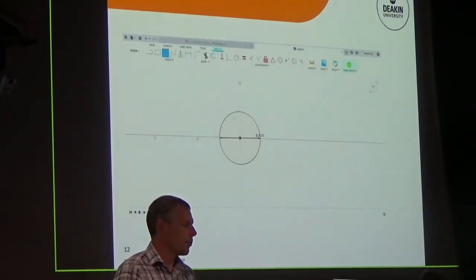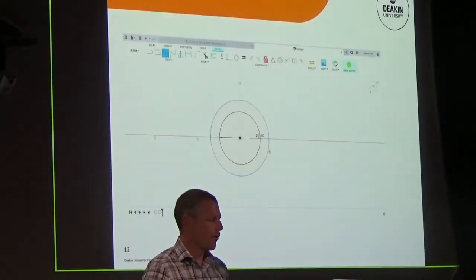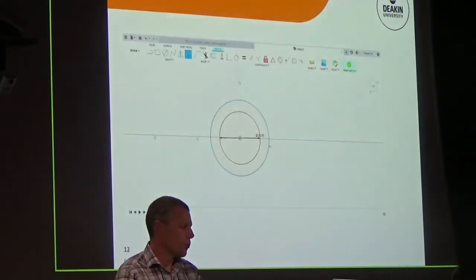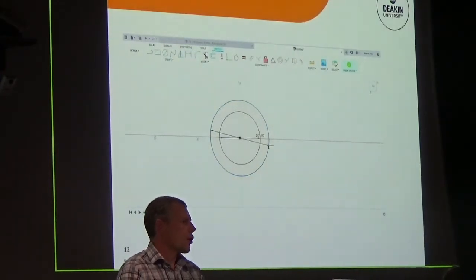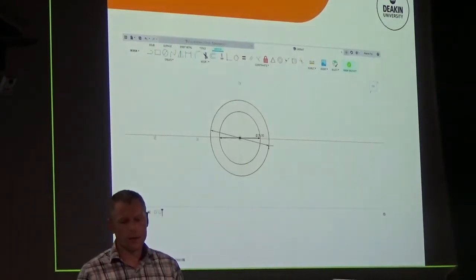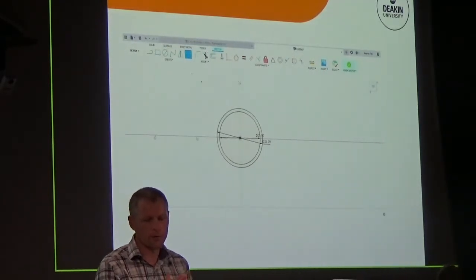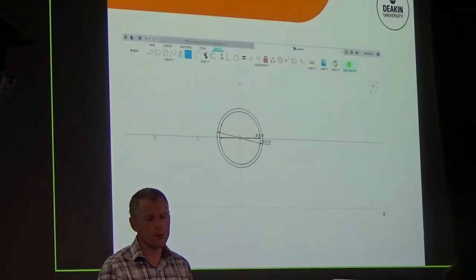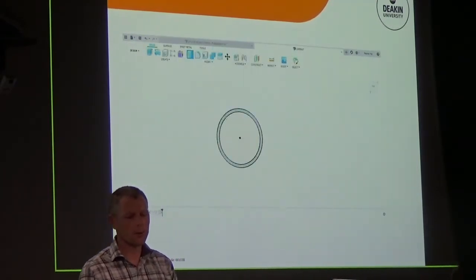So this is a very simple design process. I've gone to the same centre axis point, drawn another circle, and I'm very excited again that now I've modified that circle to be about that size, and just getting the measurements. The computer-aided design software allows you to draw lots and lots of different shapes. So if you do get into this, you'll be able to look at different shapes and sizes. So I've just manipulated that. Now I've got a 3 mil difference between the inner circle and the outer circle, which correlates pretty nicely to some of the material that we use.